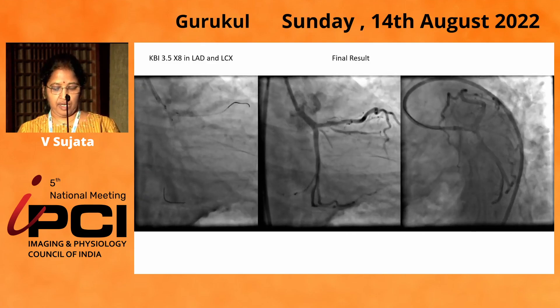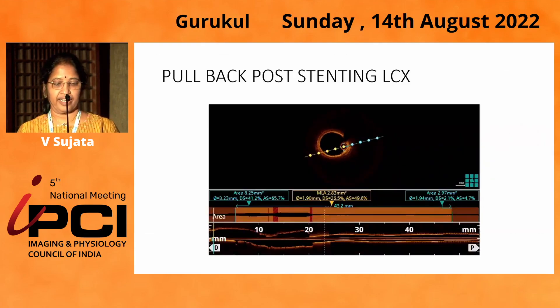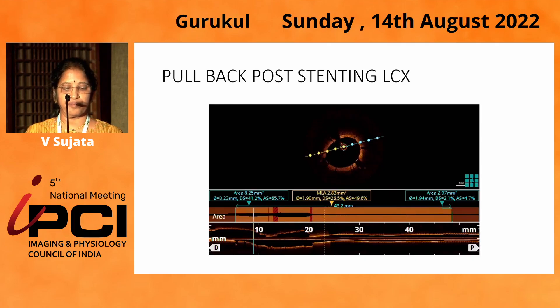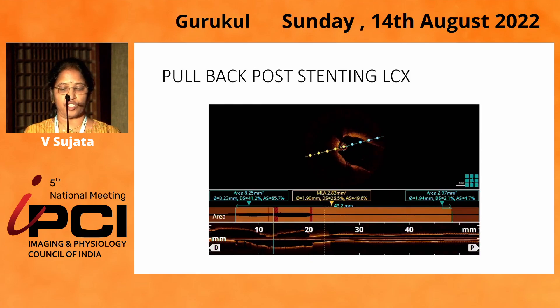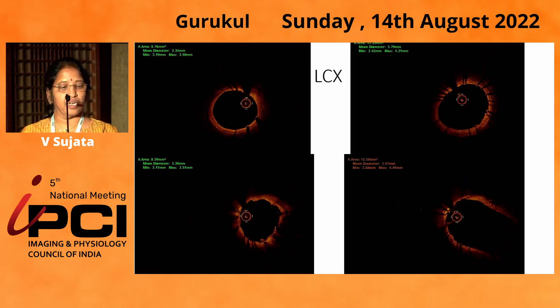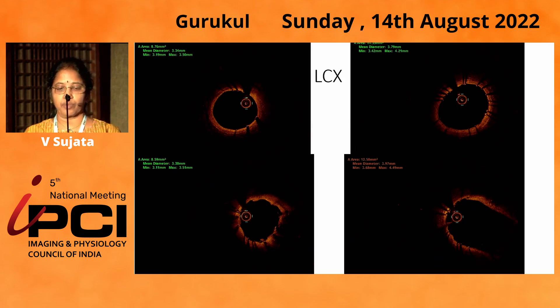This is the final result. On post-PCI pullback from the LCX, you can see the stent is well opposed and well expanded. We achieved very good lumen areas in the LCX: 8.7 and 8.6 mm².